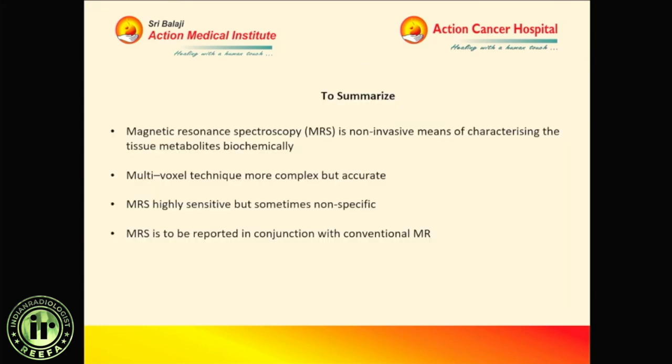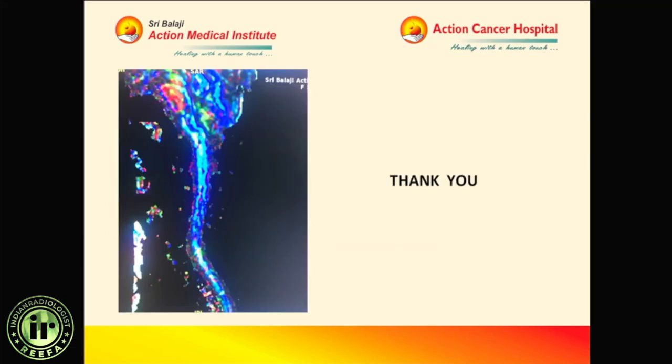So to summarize, MRS is a non-invasive method of characterizing tissue metabolites biochemically. The multivoxel technique is more complex but accurate. MRS is highly sensitive but sometimes non-specific, and it should always be reported in conjunction with a conventional MRI. Thank you.